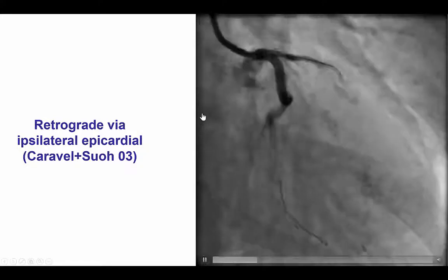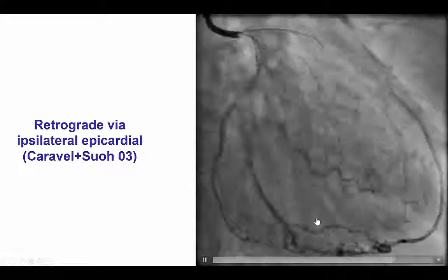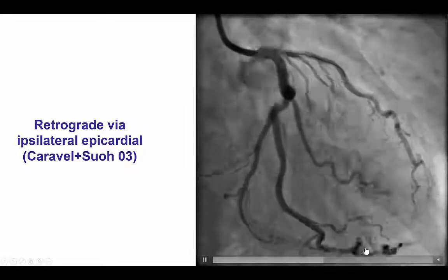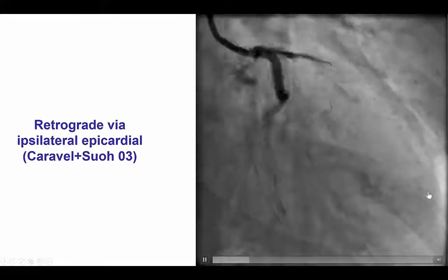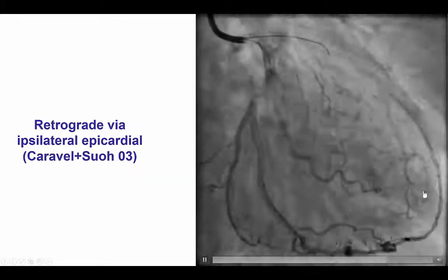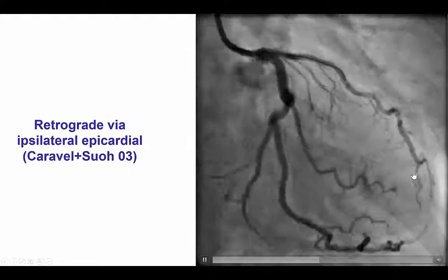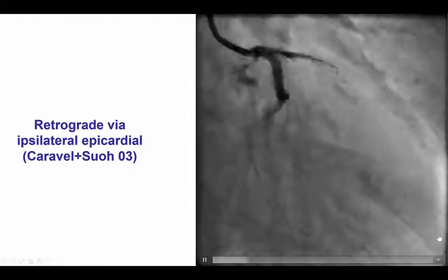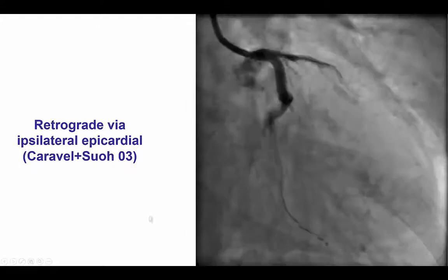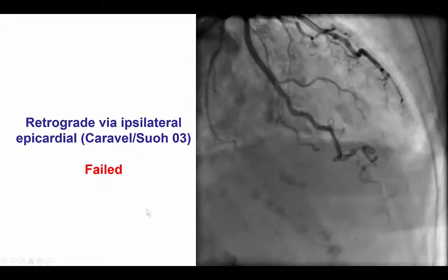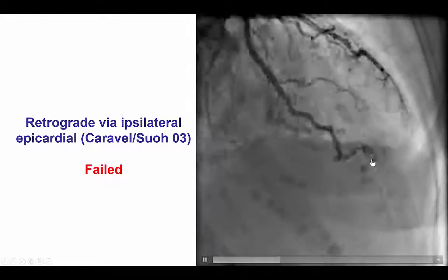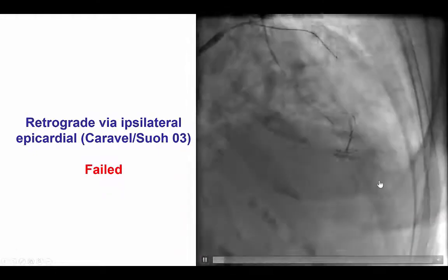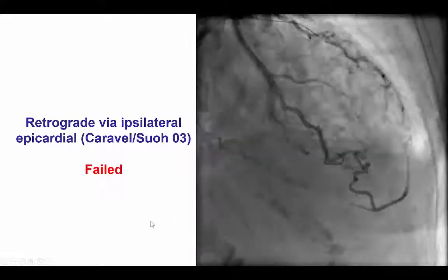We therefore tried to do epicardial crossing. We used a microcatheter through the obtuse marginal branch and then a Suoh 03 guidewire to try to wire through the tortuosity. One of the potential challenges when there is a single large collateral branch is that going through it can cause significant ischemia if flow is compromised. Unfortunately there was significant tortuosity and despite multiple attempts we were unable to advance a guidewire through this epicardial collateral.